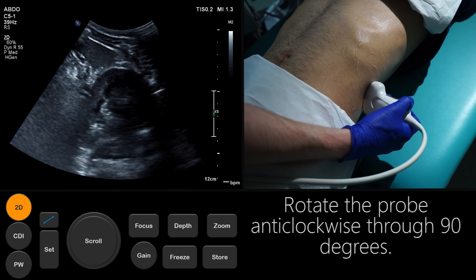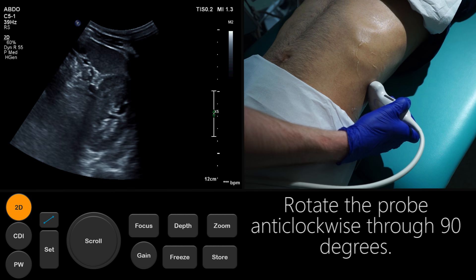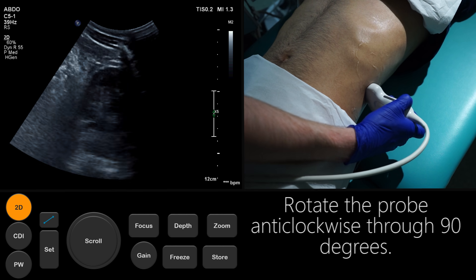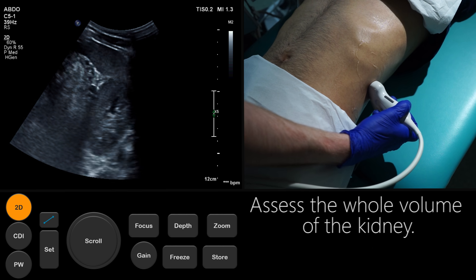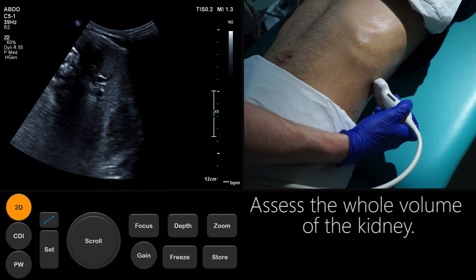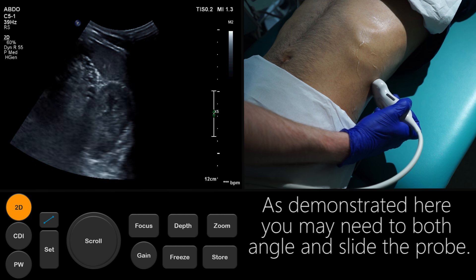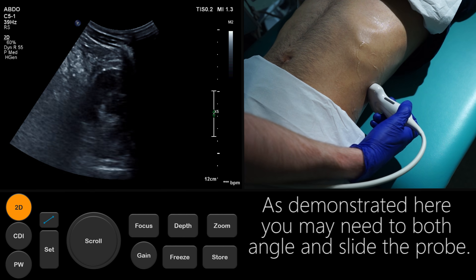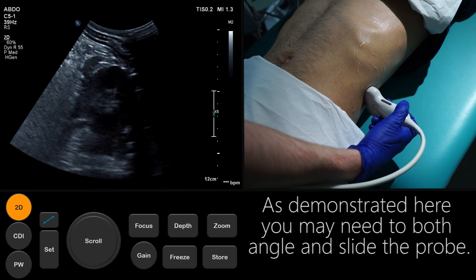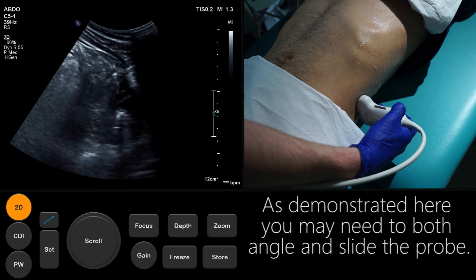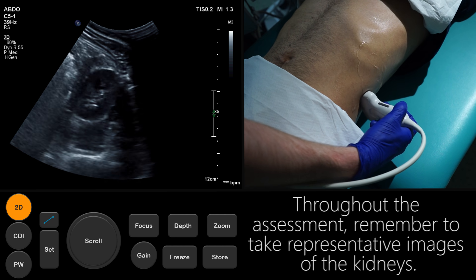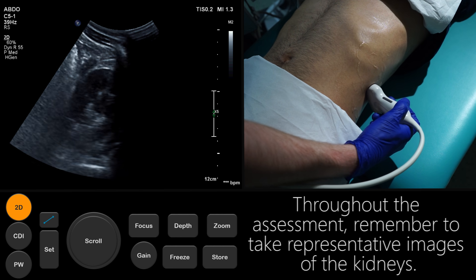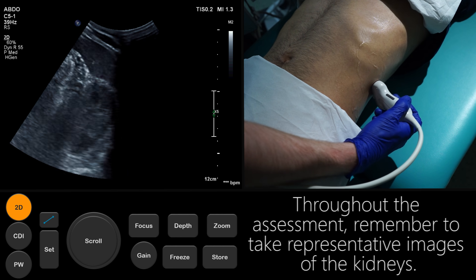Rotate the probe anti-clockwise through 90 degrees. Assess the whole volume of the kidney. As demonstrated here, you may need to both angle and slide the probe. Throughout the assessment, remember to take representative images of the kidneys.